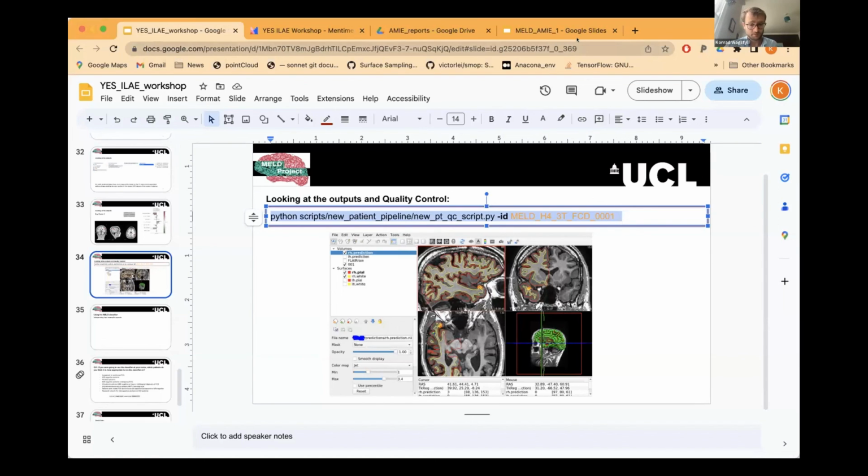So the highest reliability was just using the T1 or the T2, both within session and across sessions longitudinally, above 0.9. For volumes it was high for everything. But for the thickness measures, when we used the flare, the reliability dropped to like 0.6. It was kind of wow.